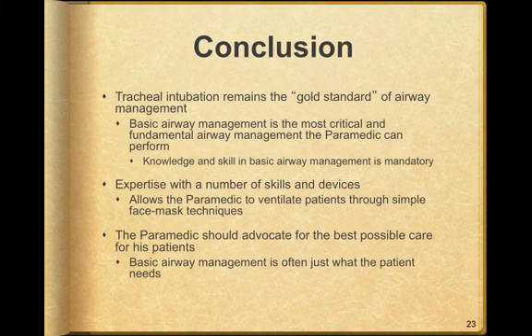Conclusion. Tracheal intubation remains the gold standard of airway management. Basic airway management is the most critical and fundamental airway management the paramedic can perform. Knowledge and skill in basic airway management is mandatory. Expertise with a number of skills and devices allows the paramedic to ventilate patients through simple face mask techniques. The paramedic should advocate for the best possible care for his patients. Basic airway management is often just what the patient needs.